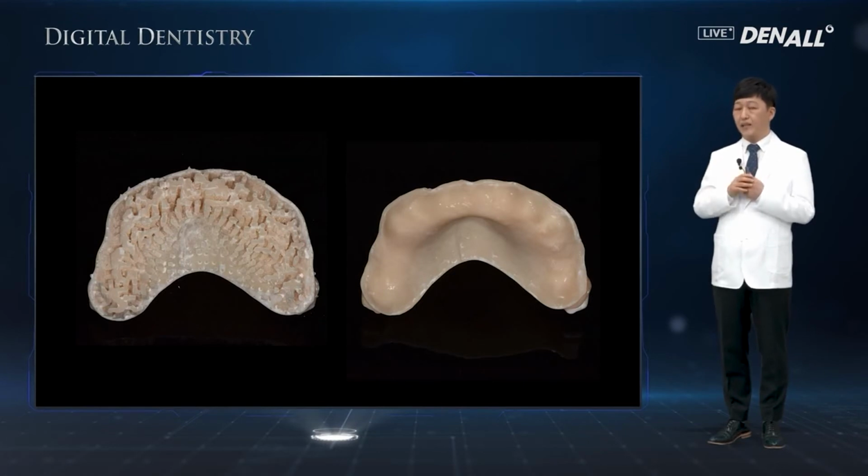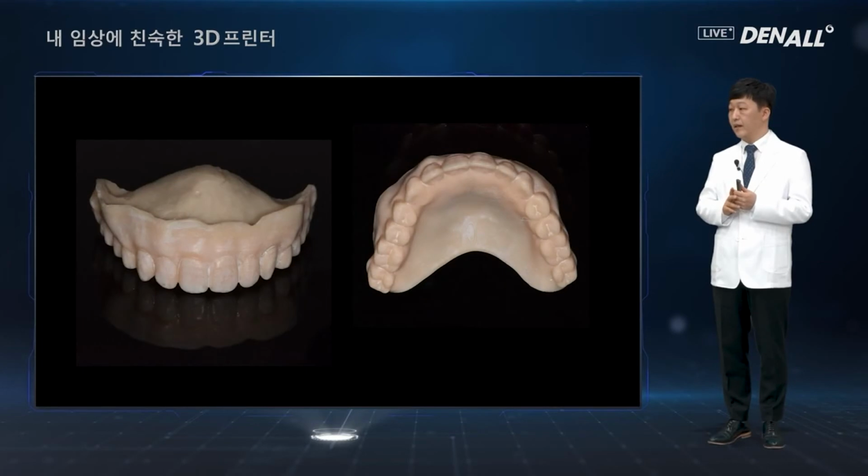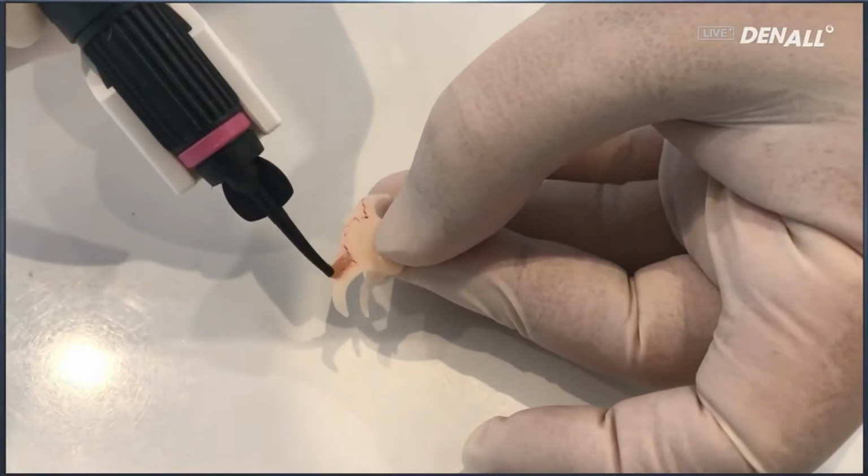Anyway, the inside of the denture needs to be rebased because during the ridge healing period, changes are occurring. So accurate fitting of the inside of the denture base may not be necessary. After the adjustment of the inside, gingiva coloring should be done using flowable resin. The gingiva color can be made.